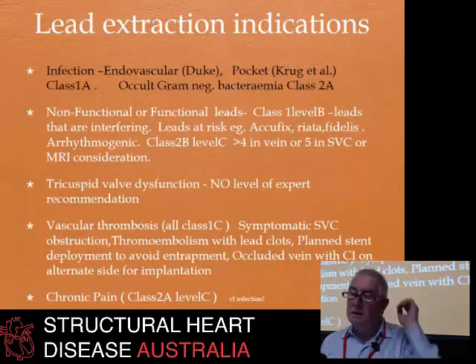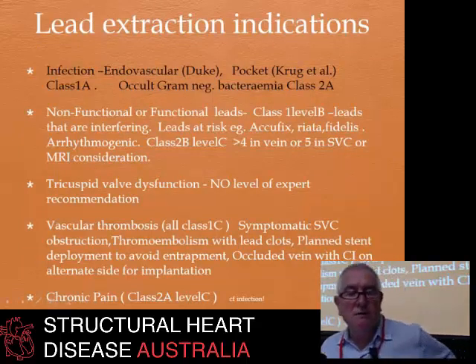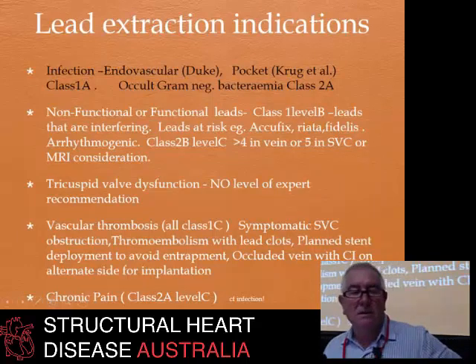So what are the indications for lead extraction? Well, there's infection, and infection basically, and then there's a few other indications.